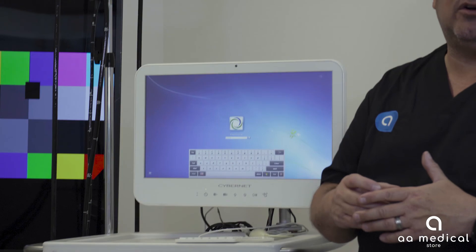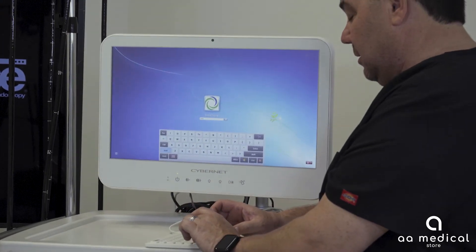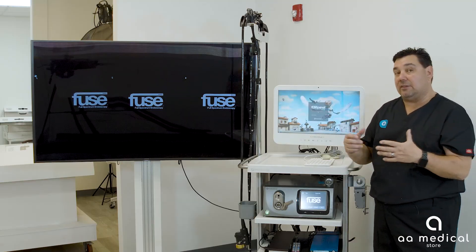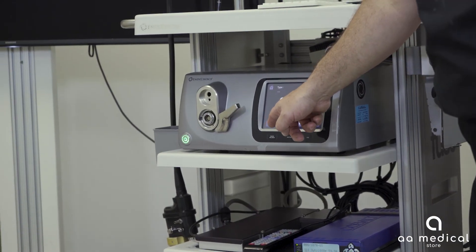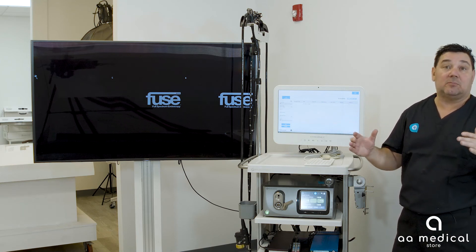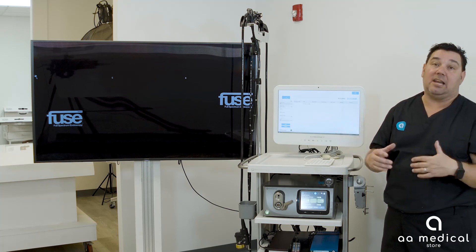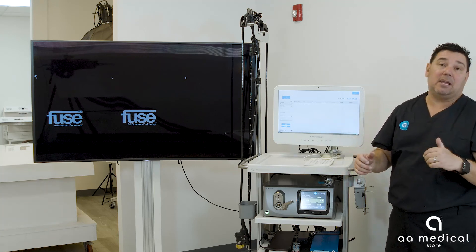Step one: log into the system. The login is 'EndoChoice' — all one word, capital E and capital C. Hit enter and the device will boot up. You can then go to the setup screen and navigate to setup number four, which confirms all three camera systems are wired up and working. If you don't see green boxes, that's an indication something is hooked up wrong or backwards. Make sure you have three green bars in setup menu number four before proceeding.